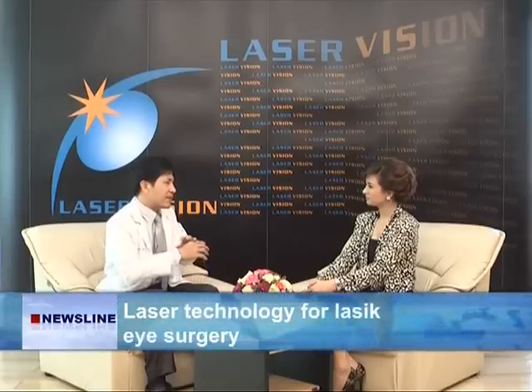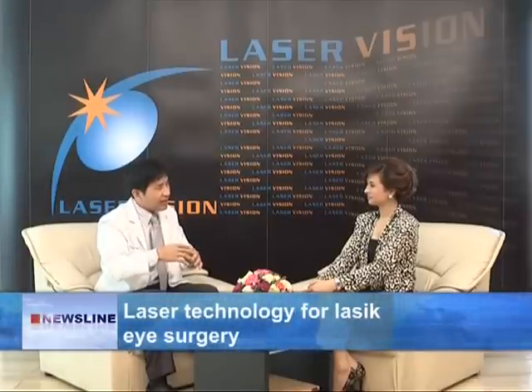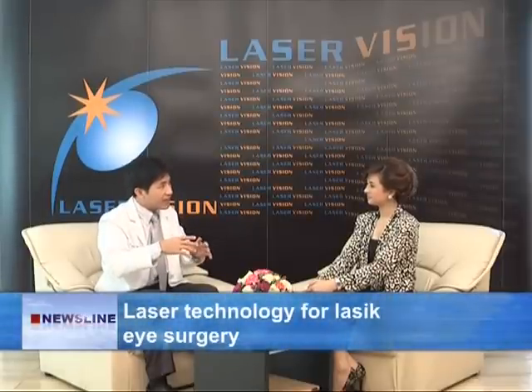Some mild side effects are there, because we create a corneal flap and there is a healing process of the eye. So at the beginning you may have some dryness of the eye, and this can be treated by some lubrication, what we call artificial tears, for a period of time, and then you could be back to your baseline.